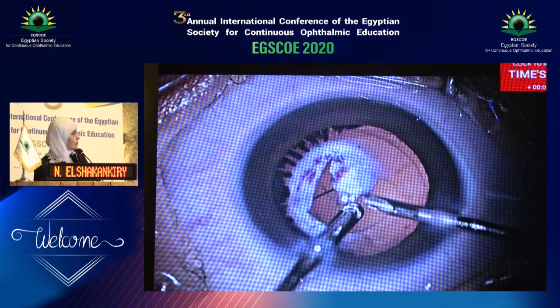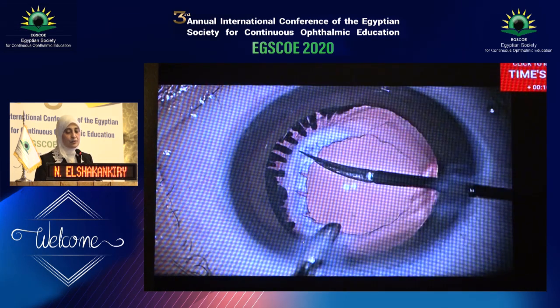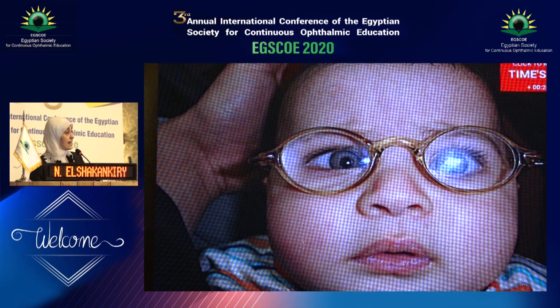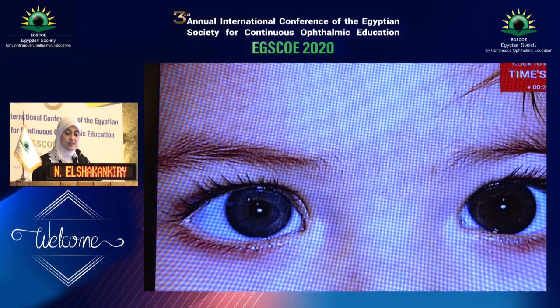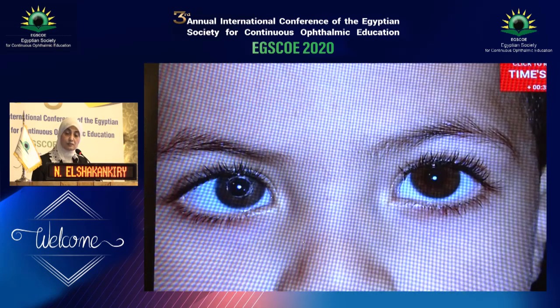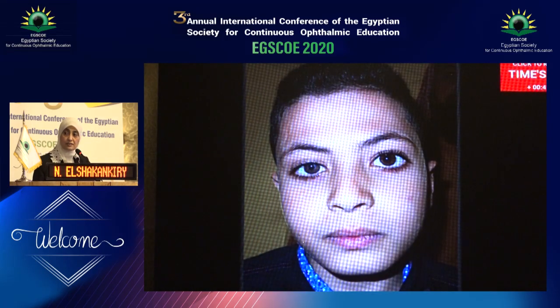And can you see here, just half a minute. During vitrectomy, you can see here the stump of the hyaloid artery. Here, after clearing the visual axis and then cutting with the radial tears at conclusion of surgery, here is the baby immediately after surgery, wearing the aphakic spectacles half waking hours and patching the normal eye, maintaining straight eyes along the months. And here, after secondary IOL implantation, 4 years after surgery, still maintaining clear eyes and straight eyes, and 10 years after surgery, still having straight eyes.